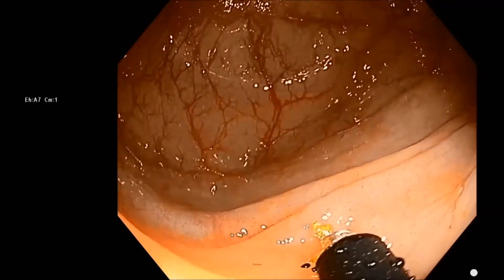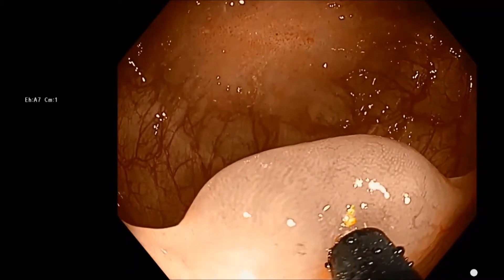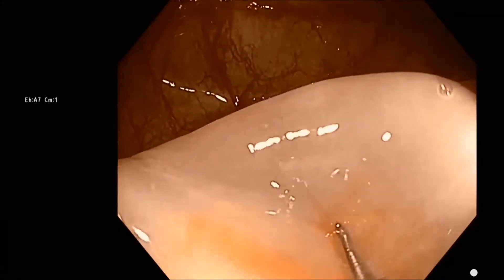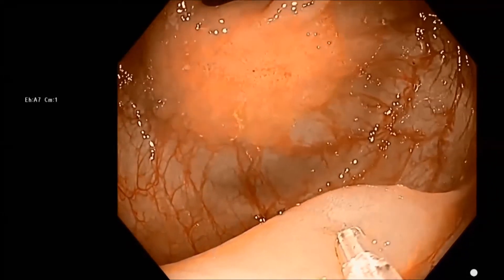Admittedly, this could be up to about 80% of the circumference, but where the lesion is centered, back about three centimeters distally. We're using the bleb technique, where we first put in one ml of saline and then follow that with one ml of Spot into that saline bleb.